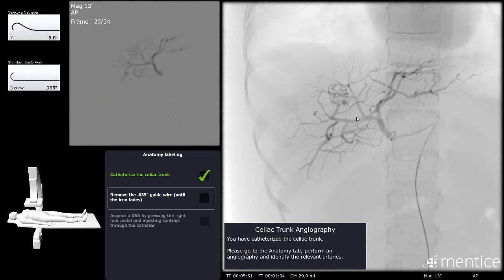So what I would say to you is that when you're doing a TACE, this is why you interrogate the arterial anatomy. You also, as I said, are looking for where is the celiac artery if you can find it. On previous angiograms, you will probably see the gastroduodenal artery come down in this way. And I would have already identified where the right gastric and the left gastric arteries would come from.